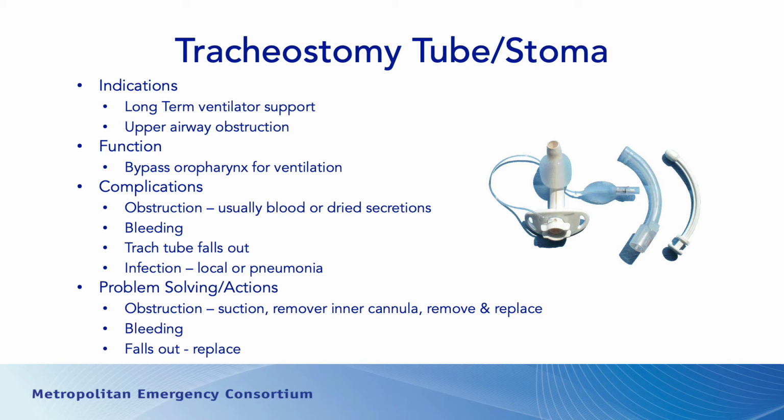Bleeding, like I mentioned, if you have localized bleeding around the cuff, you can just pack it with some gauze. If you have actually bleeding coming up through the tracheostomy, suction the patient as best you can, move that patient, get them to the hospital.